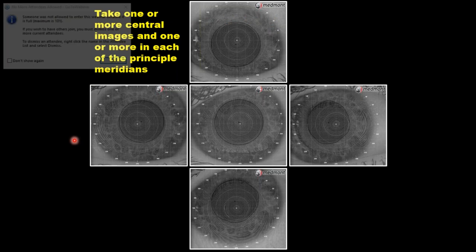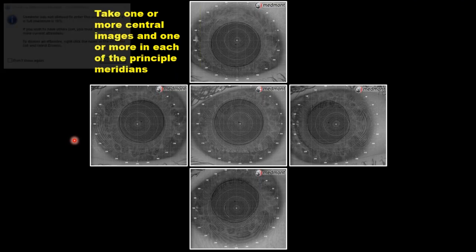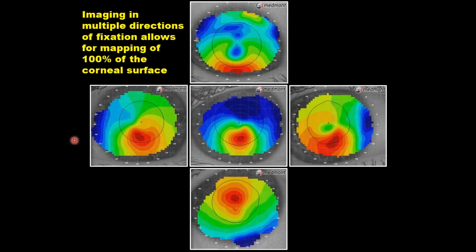Una de las cosas que hace Medmont — y es el único topógrafo que lo hace en el mercado a nivel mundial — es que es capaz de hacer la topografía en diferentes puntos de fijación. Como ven en esta cruz: en el centro, en la parte superior mirando hacia abajo, inferior mirando hacia arriba, y a los dos lados mirando para nasal y temporal. Lo que estamos haciendo es moviendo esos anillos de Plácido a las áreas no captadas.